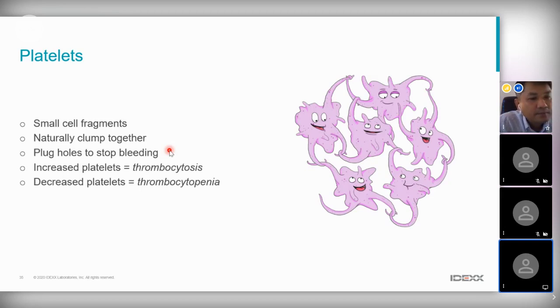Ok. So platelets are very important cell fragments because they clot together, save us from the uncontrolled bleeding. But there is a big problem with the platelets, not because we can't measure them, it's because they have a natural tendency to clump together. And hence they behave funny sometimes, and they clump together, and that leads to their pseudo counting. Ideally, this thrombocytopenia, which is pseudo thrombocytopenia.